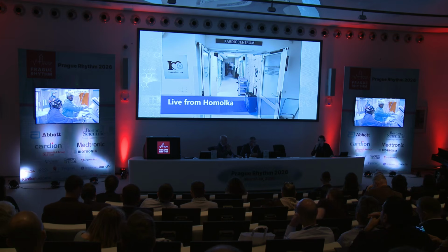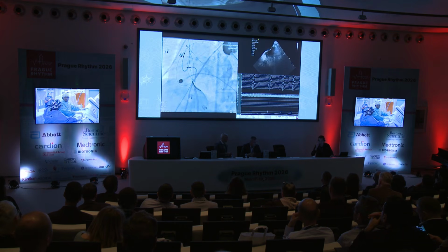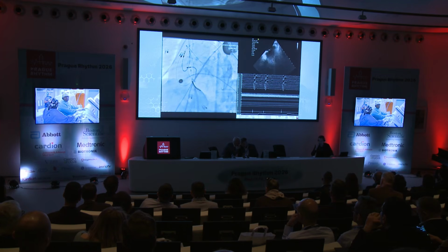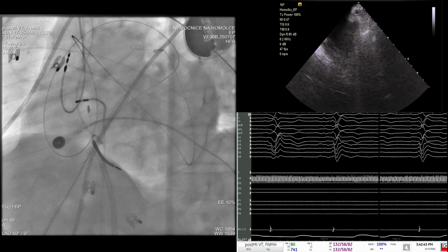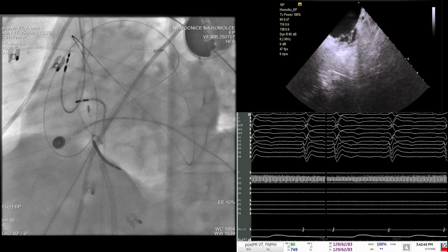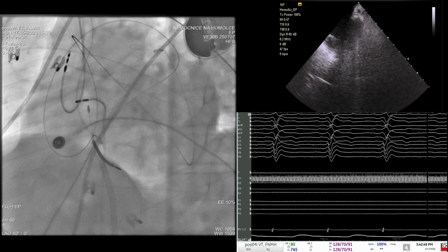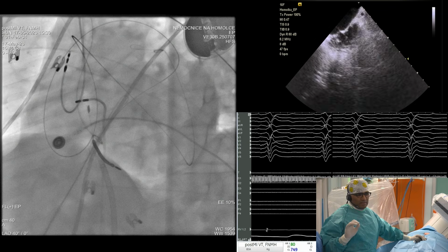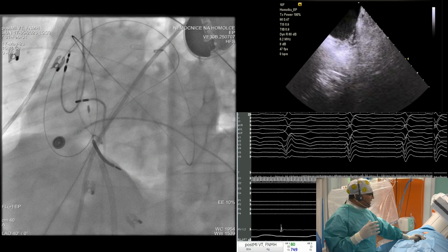Okay. Are you guys here? Did you hear me? Can you guys hear us again? Can you guys hear us? We do. We are back with you. We are seeing that you have wire in the pericardial space. Can you hear us actually? We hear well. Okay, great. So what we'll do is, I guess we're not ready elsewhere.